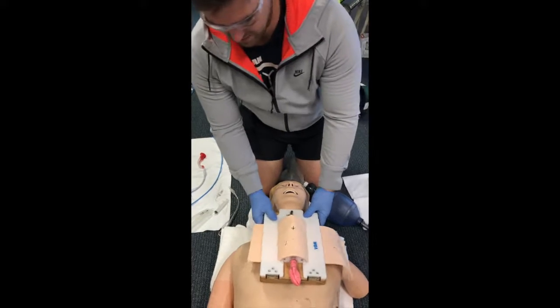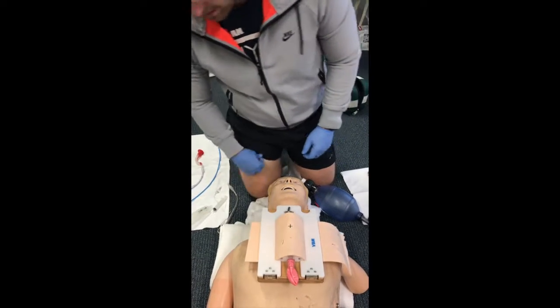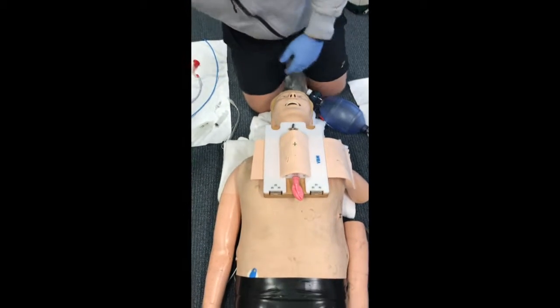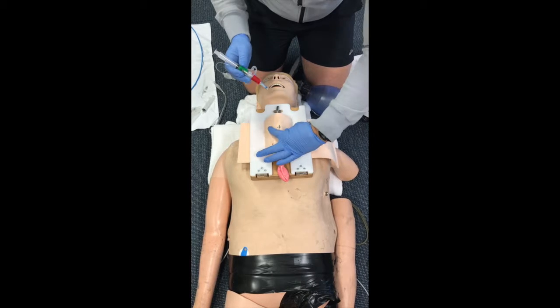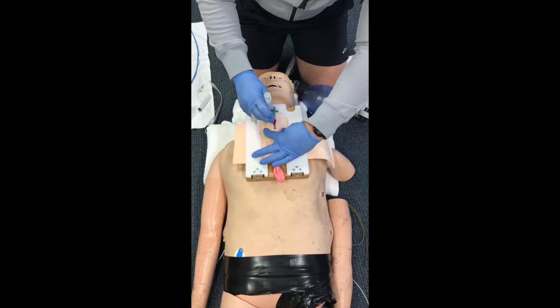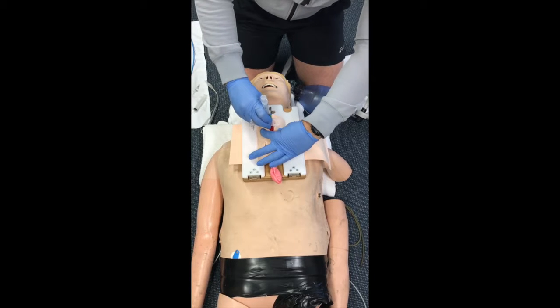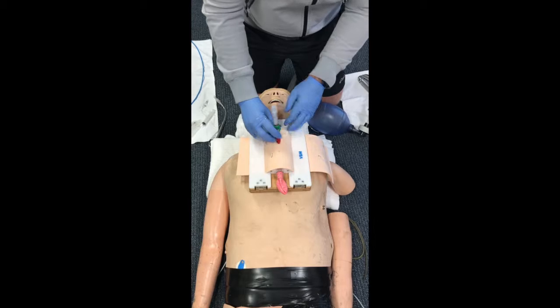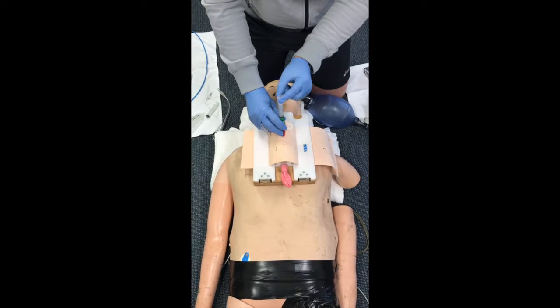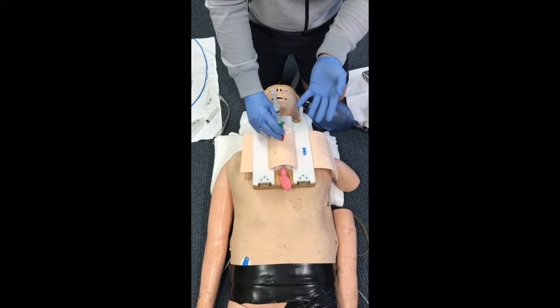Got my little airway here. So I've pre-marked my cricothyroid membrane prior to intubation attempts. I've got my QuickTrak here. I pinch the skin, and at 90 degrees, I advance the QuickTrak to the red stopper here. So I've stopped at the red stopper here. I aspirate my cannula, and if I'm able to aspirate, I know I'm in the trachea.